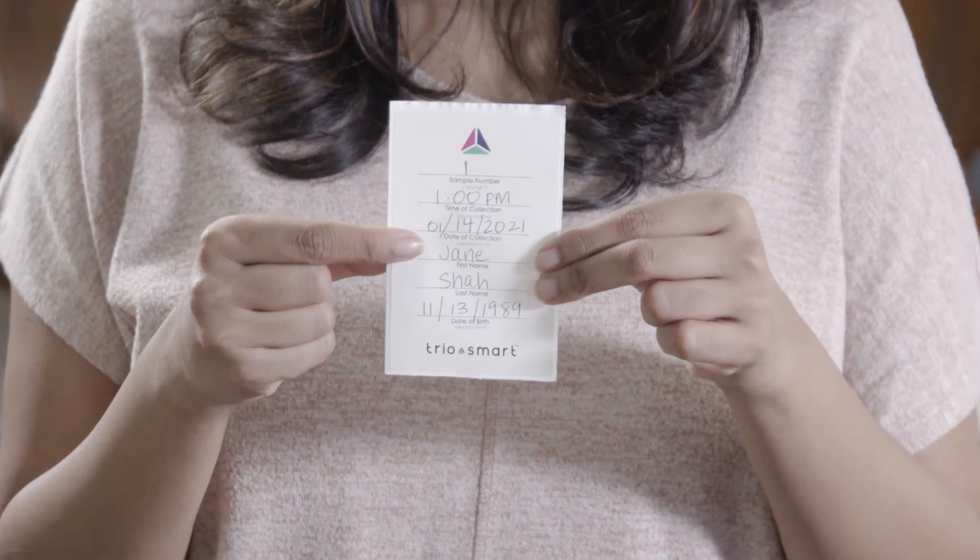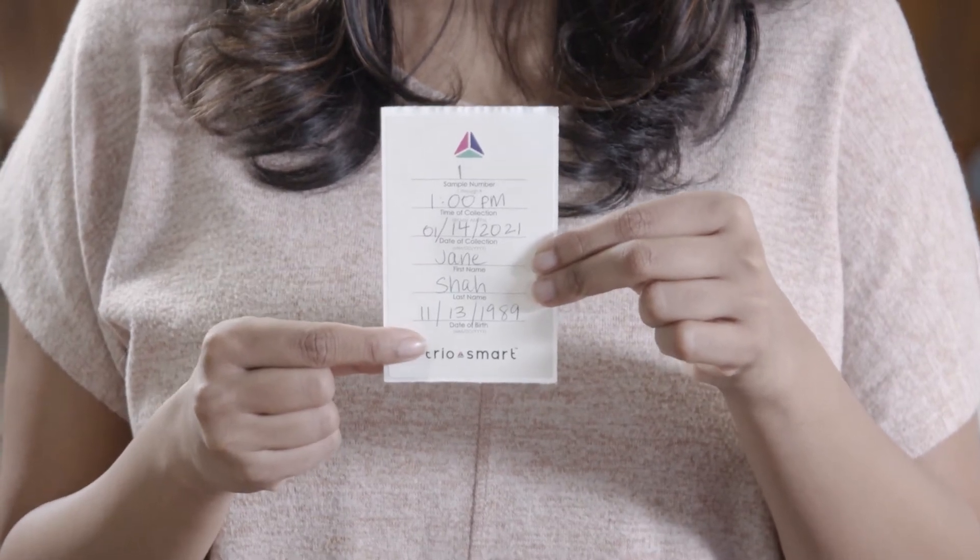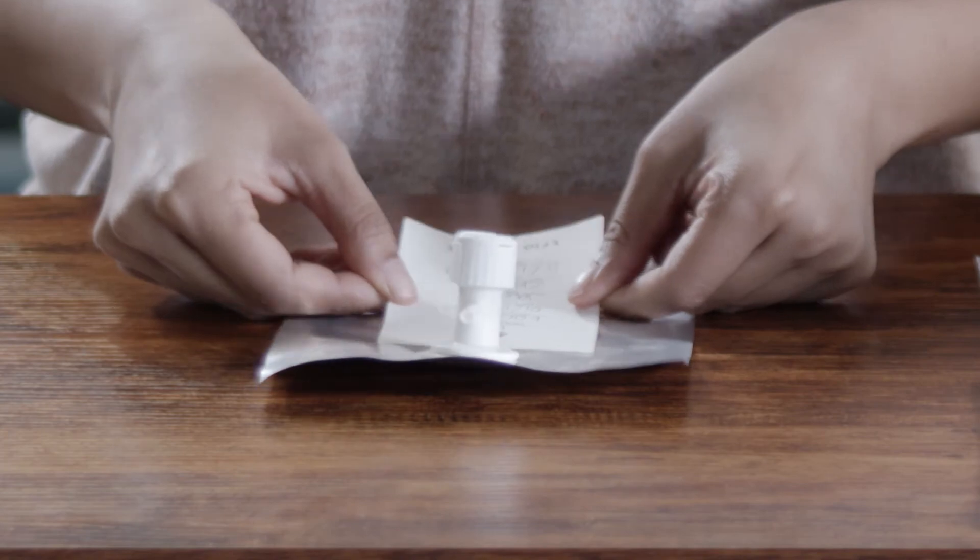First, complete a sticker label starting with number one. Then add the time of collection, the date of collection, your name, and your date of birth. Stick the label on the bag like this. You'll do this for each collection bag.